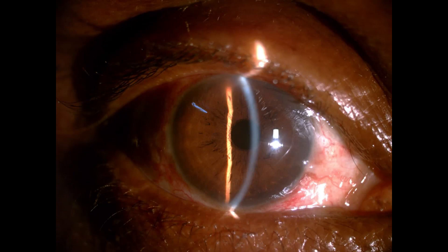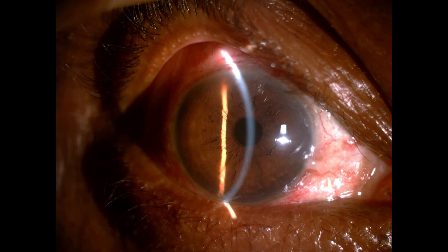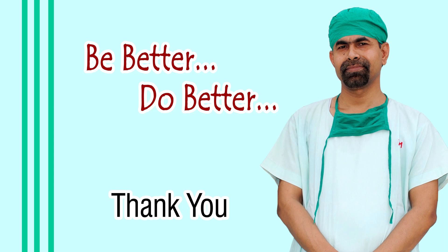These pictures have been taken three days after surgery. The cornea is clear, the anterior chamber is quiet, and unaided vision is 6/9. The wound is nice. The conjunctiva is apposed to the limbus very nicely. This is an initial experience of a pre-chopper assisted small incision cataract surgery. Thank you very much for watching.